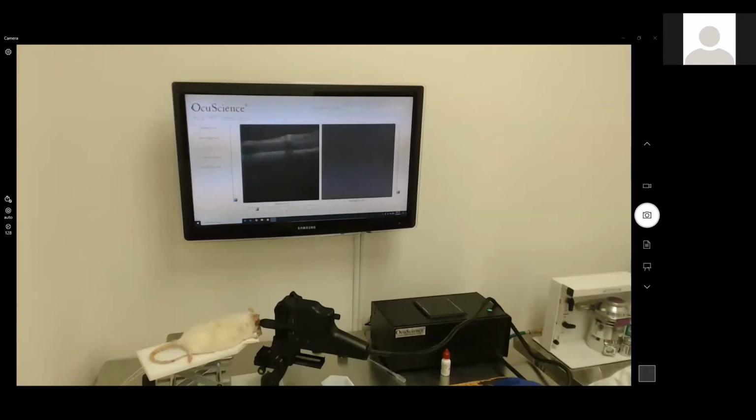I wish I would have had that rat's head nice and still, then I would have some really nice data to reuse. But I think you can see from this, it's very nice and consistent. You're getting good segmentation and layering all the way through the motion. And that's always a challenge when doing 3D OCT, with my system or otherwise. Sometimes you don't know where the scanner's going and how well it's focused, because you might be on the absolute back of the eye and then you start moving to the forward edge of the eye and you've got the curvature to deal with. Now you start rolling off of the screen because the tissue distance is different. That's one of the challenges of doing 3D OCT, and that's one of those things where practice basically makes perfect.